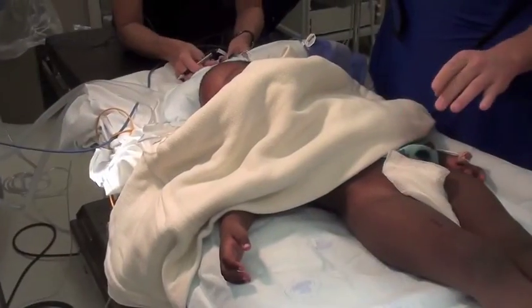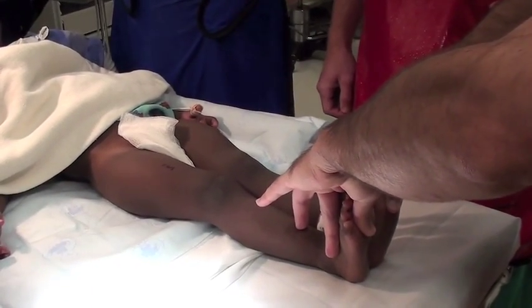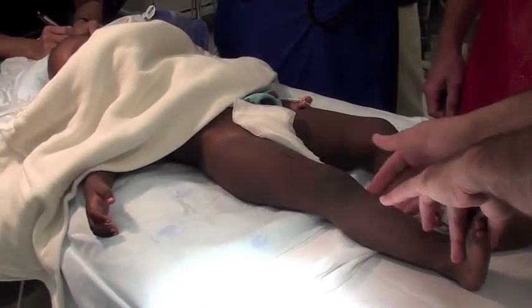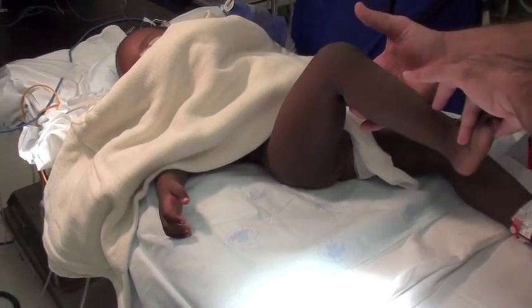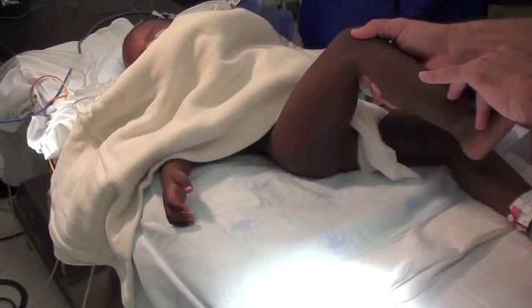This is a little bit older child with a dislocated hip on his right side. A closed reduction is going to be attempted, but it might not be as successful in this age group. You can see the hip kind of pistons in and out because it's not stable in the joint.